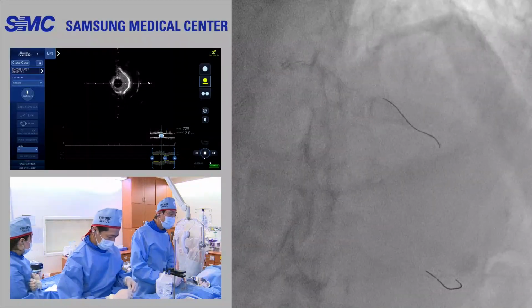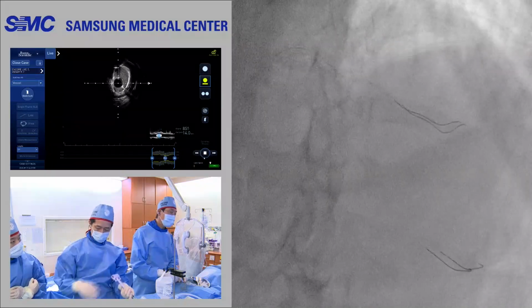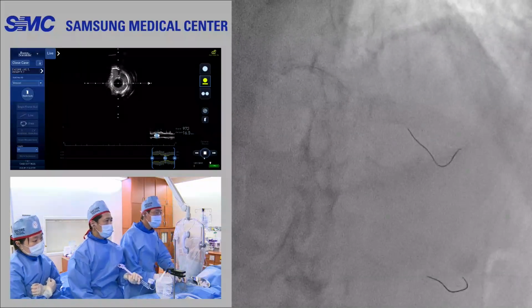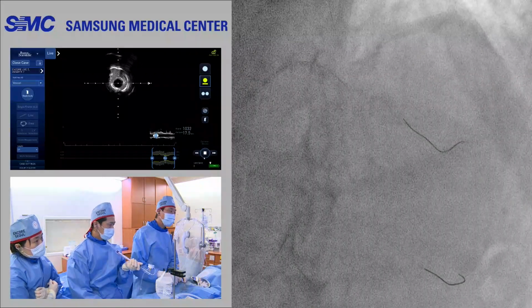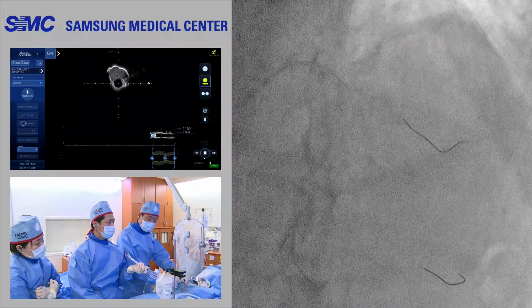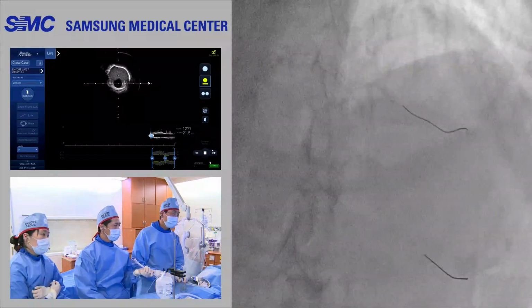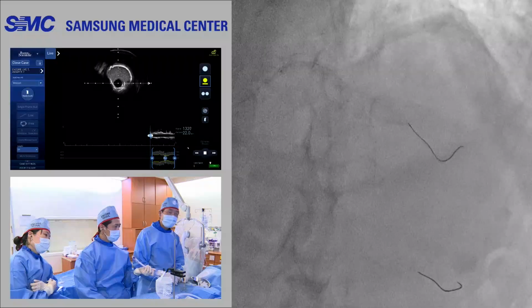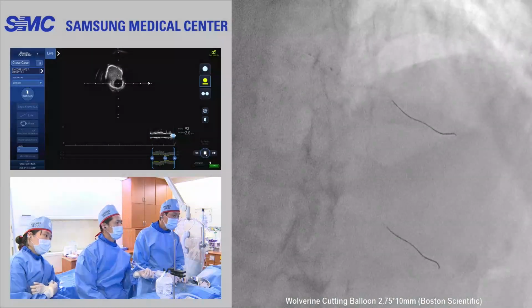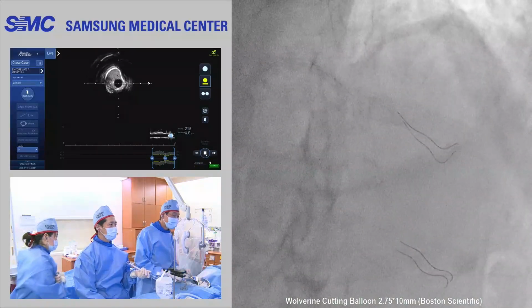So we have observed many studies and lab demonstrations, and also the lectures about calcification during the course, mostly rotablation and IVL. I think we need to explore the role of a cutting balloon in this live demonstration. Still, I'm not sure, actually.